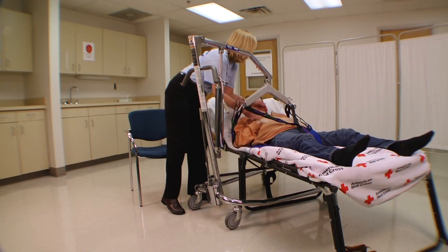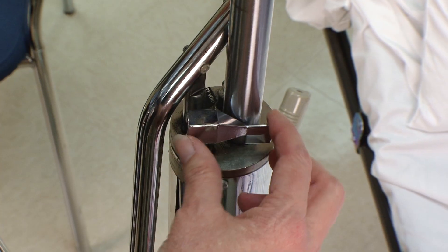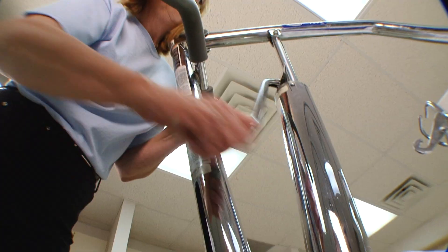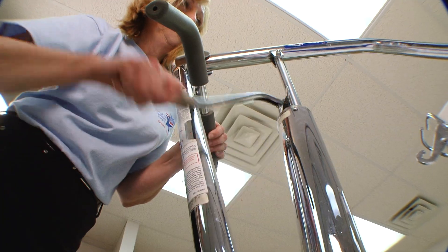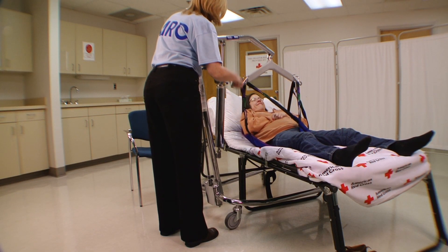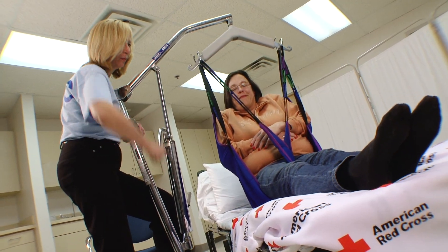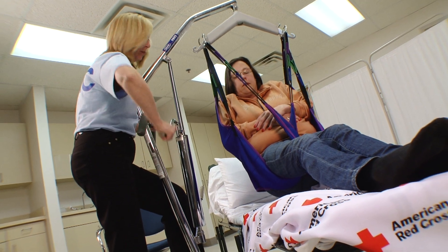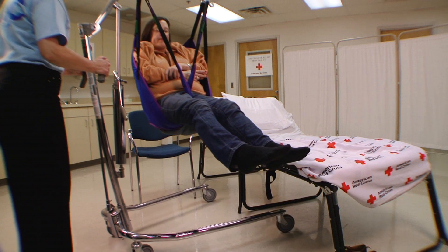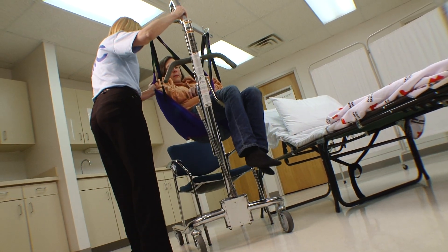The individual can cross their arms across their chest for the transfer. Close the valve on the hydraulic pump by turning the lever clockwise, and use a pumping motion on the handle to gradually lift the individual off the bed. Once the individual is totally suspended, carefully back the lift out and roll it toward the chair — the chair should fit between the legs of the lift.